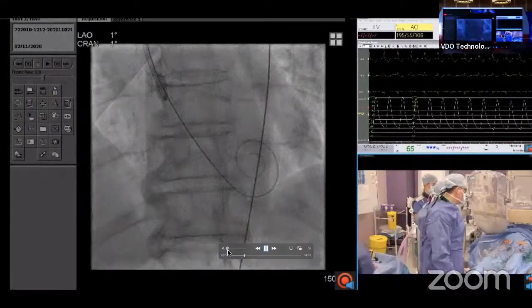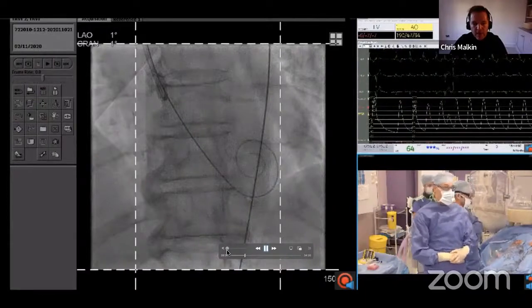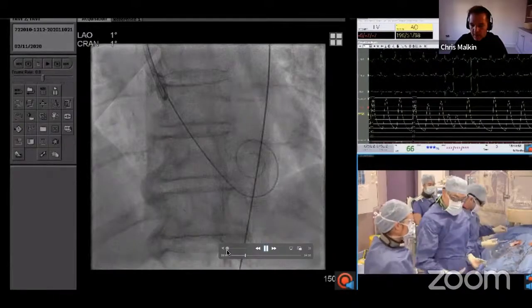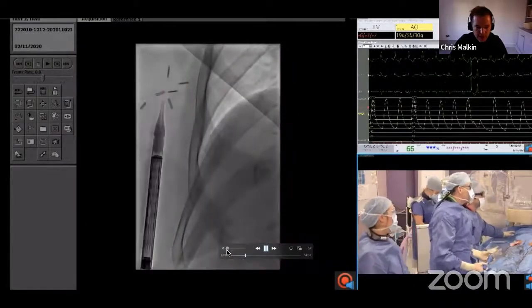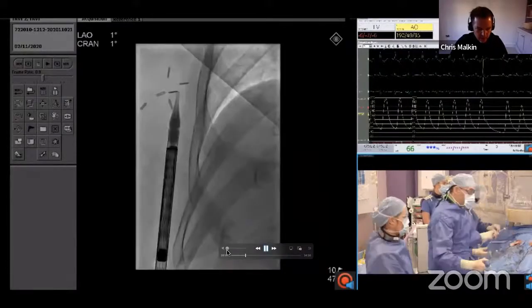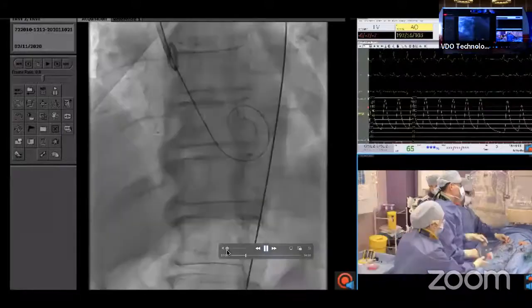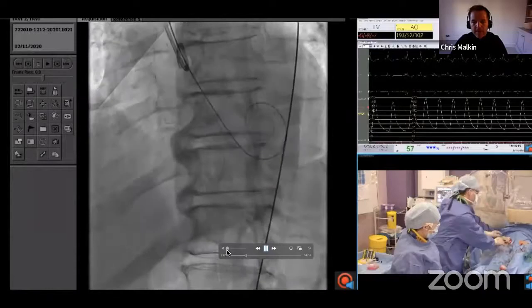So we're now going through the regular maneuver before any Evolut valve implant. You have to screen the valve to make sure that it is loaded. This is one of our other nurses who's loaded the valve for us. So you have to fluoroscopically inspect the valve to check that the paddles are integrated into the pockets. You can see that at the bottom of the screen. And you inspect the braid of the valve to make sure that it's all aligned. We elected to do a direct implant in this case. So there's no pre-balloon valvuloplasty.